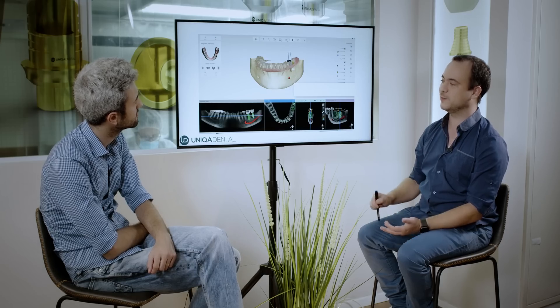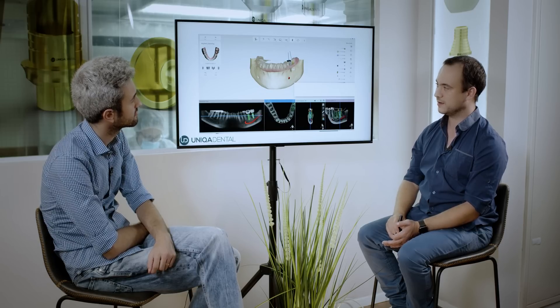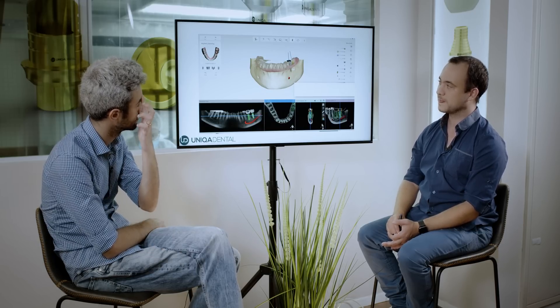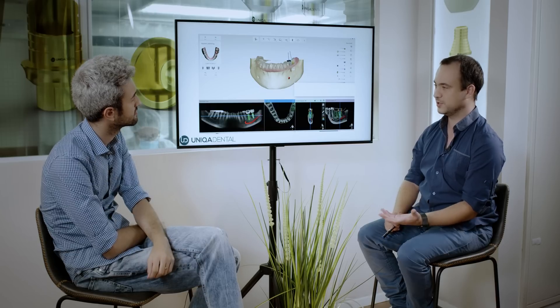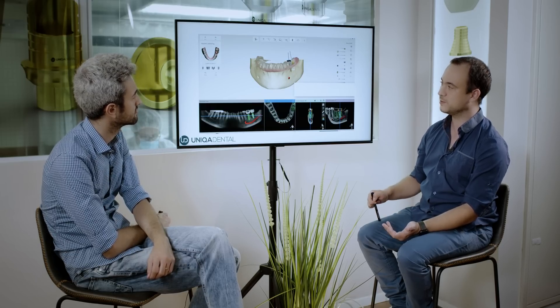Because I had a 3D reconstruction before and I have the 3D model of the patient, I can superimpose the 3D reconstruction with the 3D model — one on top of the other. Digitally. So you can see here I have from the CT the bone, the 3D reconstruction of the bone. I have the impression of the jaw that I made, and I superimposed them one onto another.